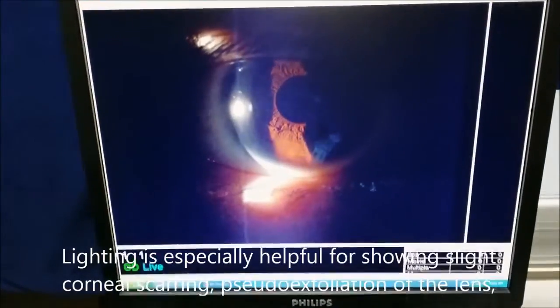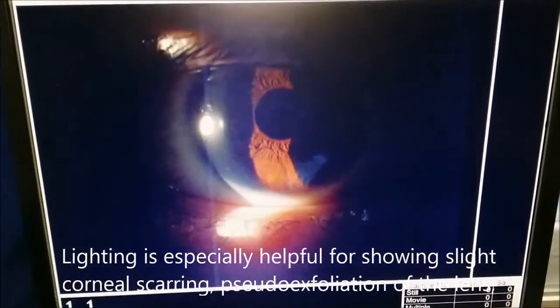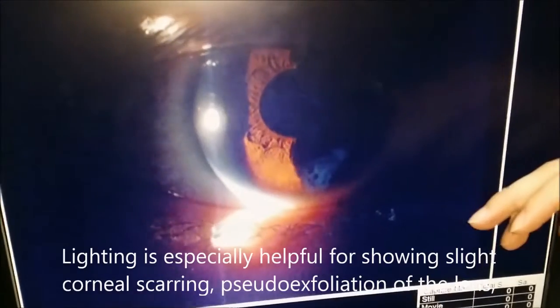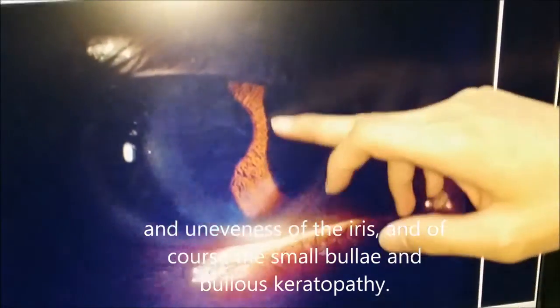If you look over here, it's especially helpful for showing slight corneal scarring, pseudo exfoliation of the lens, unevenness of the iris, and bullous keratopathy.